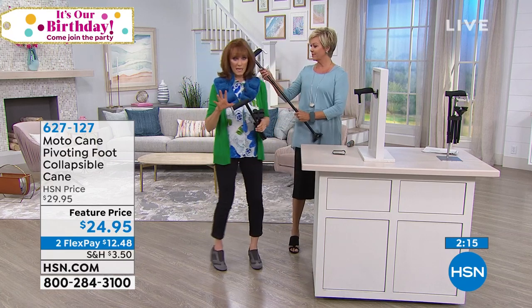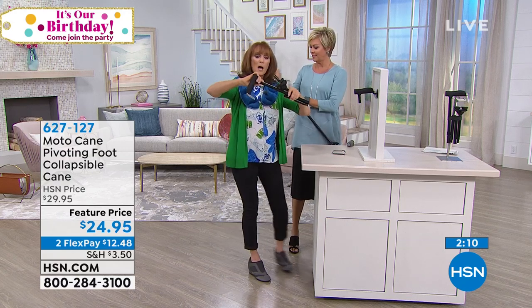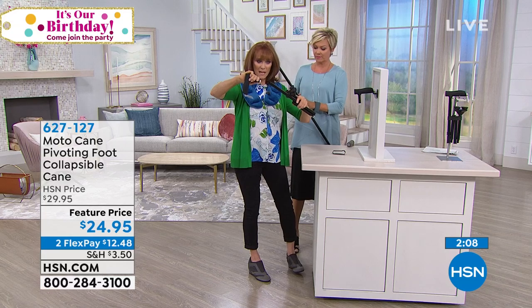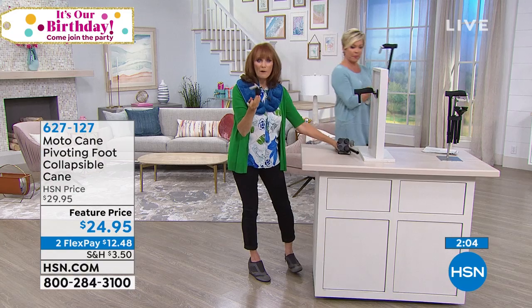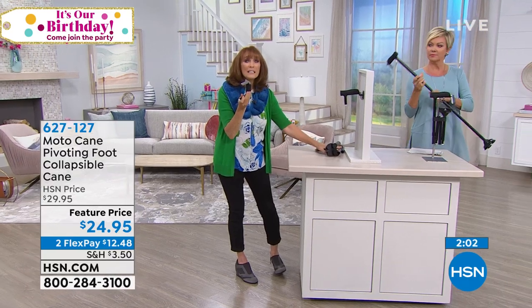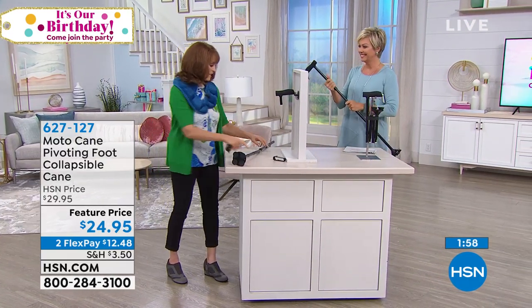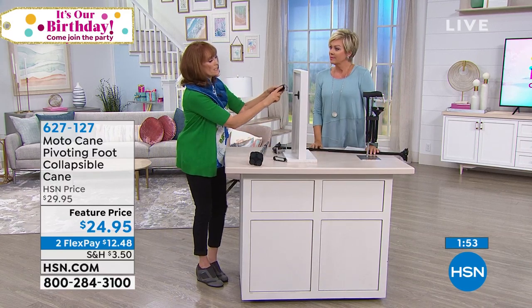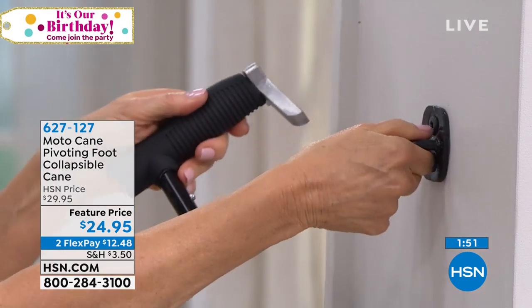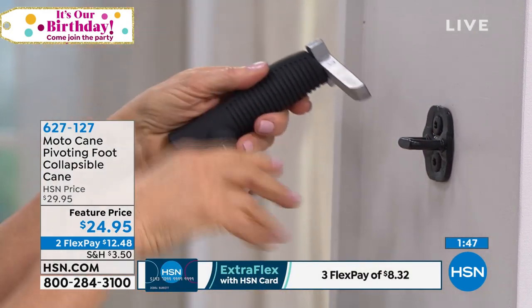Not only is it a great cane — it really does two things. The top comes off with just a push of a button. Now I have a car assist, something you would pay $20 extra for separately. A car assist goes in your striker plate. This is called the beak; this is the striker plate, found in 99% of all cars in the United States and worldwide.